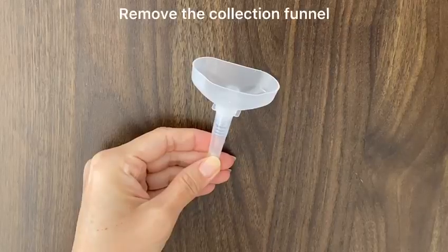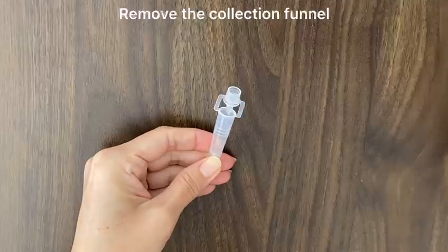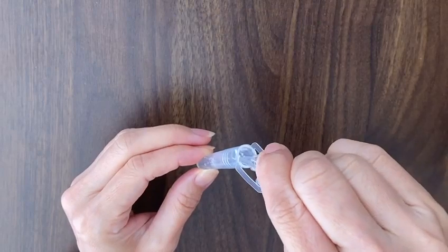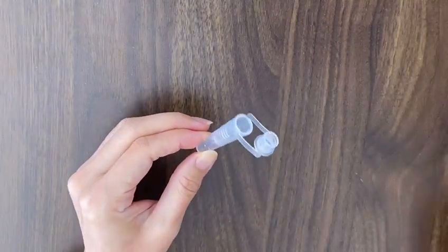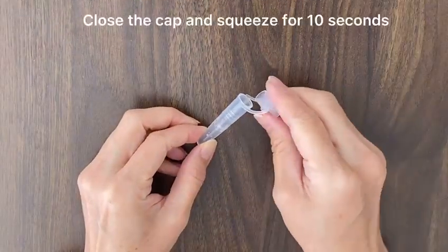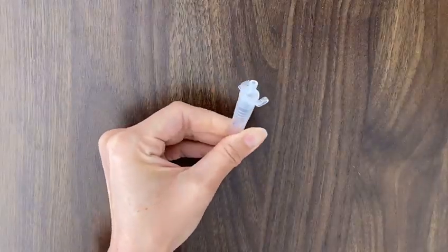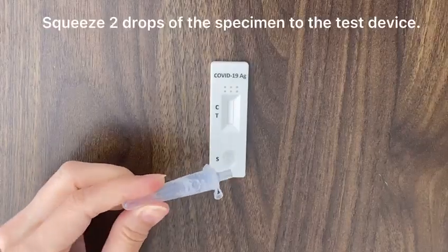Then, remove the collection funnel. Fill the entire buffer solution into the tube. Close the cap and squeeze for 10 seconds to make sure they are well mixed. Squeeze two drops of the specimen onto the test device.